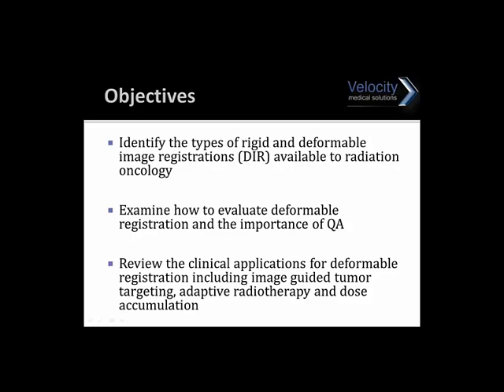So whether you're simply interested in learning more about deformable registration, are currently shopping around for deformable registration software, or perhaps you already have deformable registration, registration QA was a really hot topic at both AAMD this year and AAPM. So the timing is really to show off the latest in Velocity's deformable registration assessment tools that also usually correspond to assessment tools in other commercial products as well.